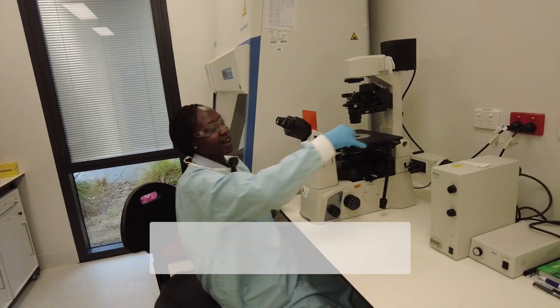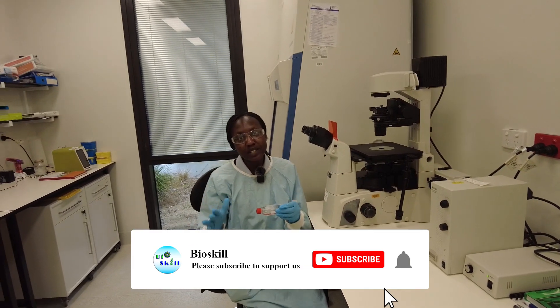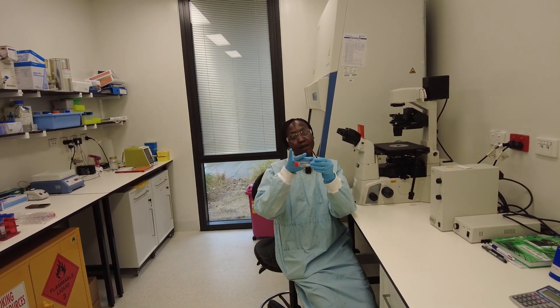So as you can see, the cells are growing well. They're about 50% confluent, which is fine. So I'm going to split them into two of the same flask.